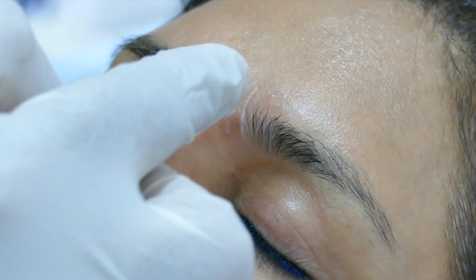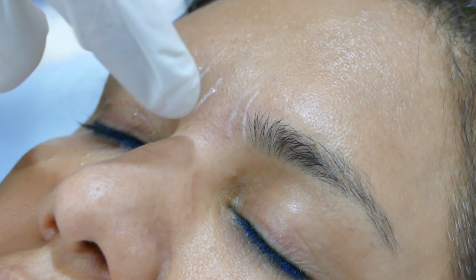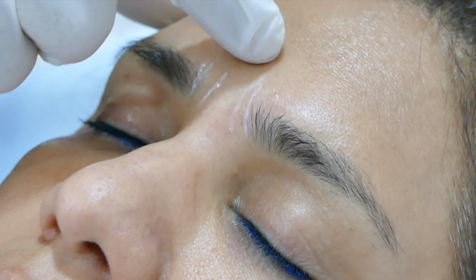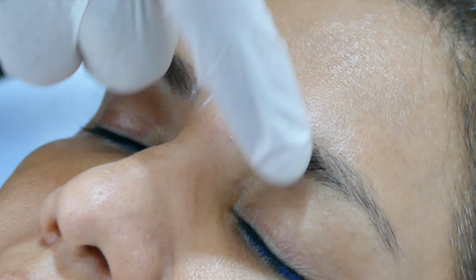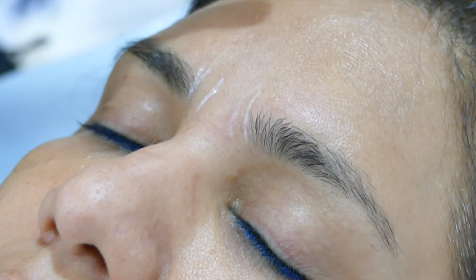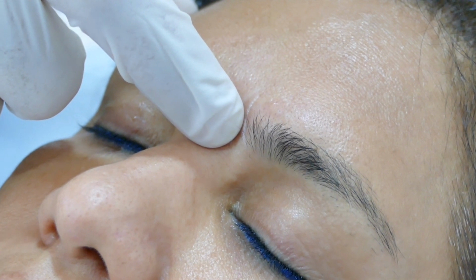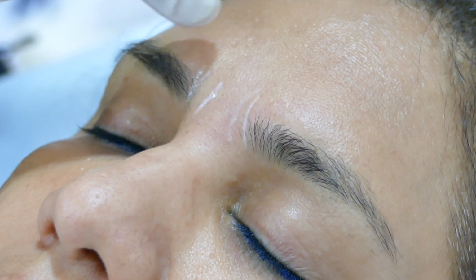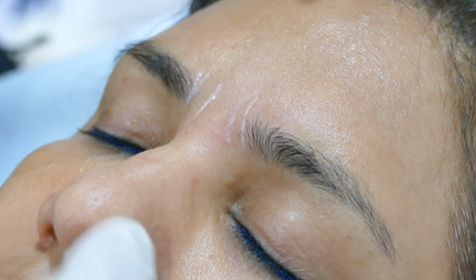Okay, so we are going to focus on the glabellar line here. Now remember, the supratrochlear vessel is right underneath the crease and the supraorbital vessel is at the mid-pupillary level. So to supratrochlear, and this area is deep, it's underneath the muscles. So the technique to inject is to pinch the skin and lift the skin up.